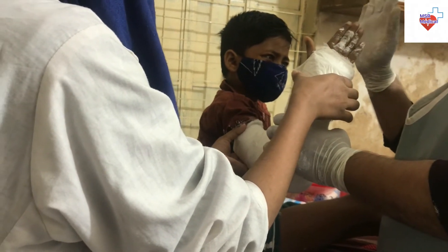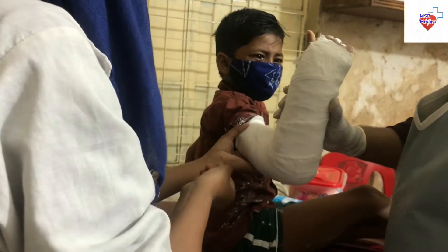The finished splint should allow excellent movement at the metacarpophalangeal joints, thumb, and shoulder.